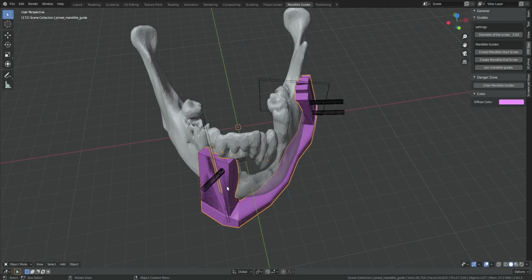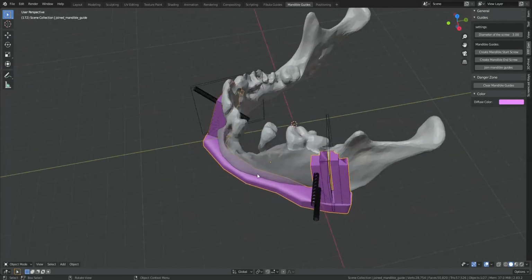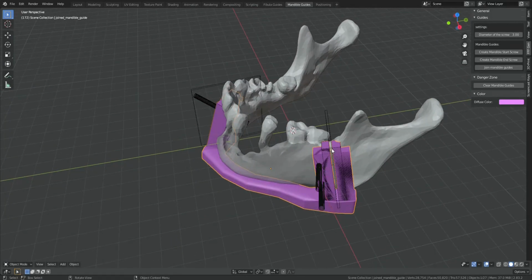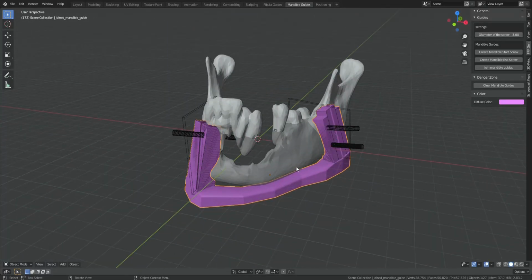They used the same angles, just moved the cutting planes further back, the same for the angular part and on the body. They widened the fragments of the fibula, and they used the same angles as we planned. So there wasn't a big discrepancy between the initial plan or virtual surgery and the operation.